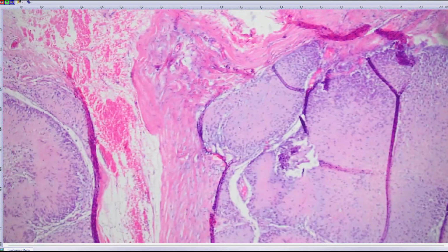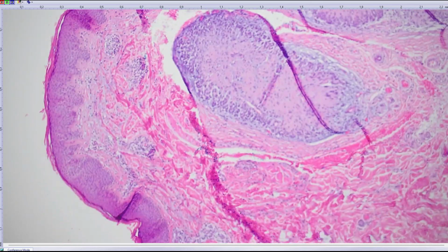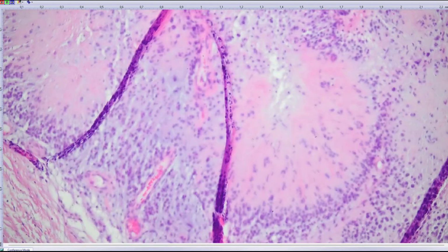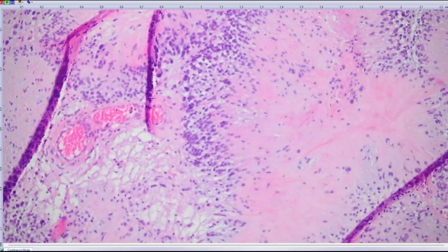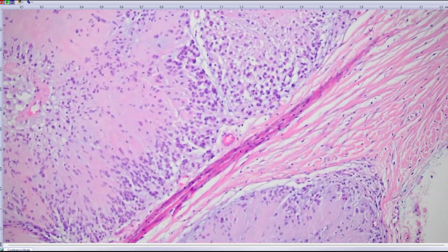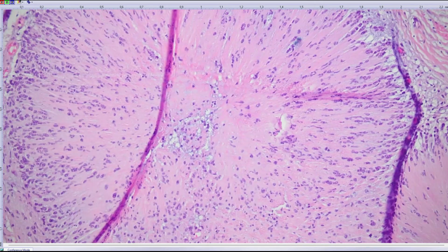It looks like matchsticks having heads open to the periphery. It is one of those epithelioid schwannomas that are usually easy to say that they are benign. You often find EMA-positive perineurium around it. I didn't try it in this case.